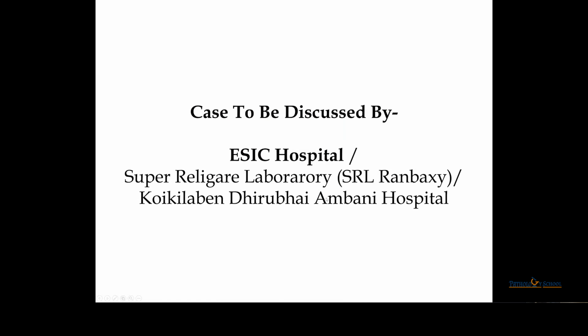I would like to call upon the representative from the ESIC hospital to discuss the case. One H&E section and its scan image was provided. I'm going to project 4 representative images of the same section.